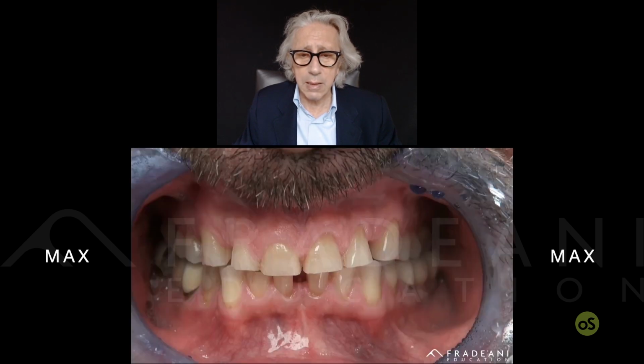So let me introduce this guy. The name is Max, he's from Florence, and he came to my office in order to really fix his teeth. That was the request of my patient: fix my teeth. So I was looking at him talking, I couldn't see any teeth at all underneath. So I believed that he was without teeth, that he needed a denture.